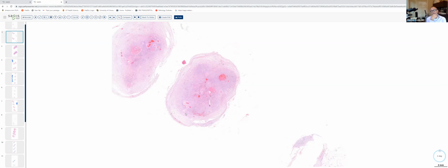And then one could also think about a giant cell tumor or fibroma of tendon sheath. The former, of course, has characteristic osteoclast-like giant cells, with scalloped borders sitting in lacunae. The giant cells kind of resemble big chocolate chip cookies. So again, schwannoma.